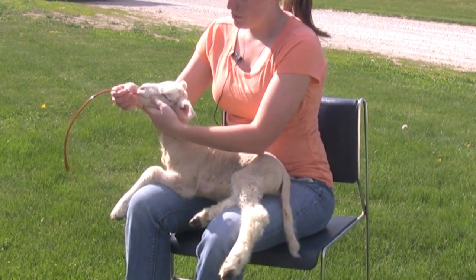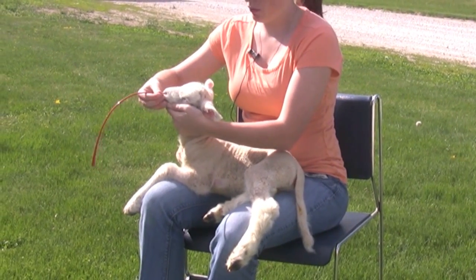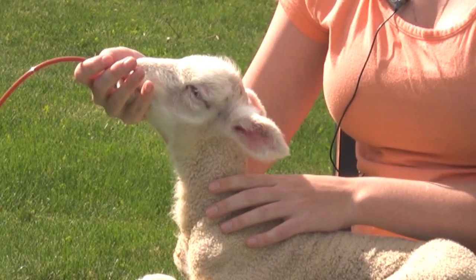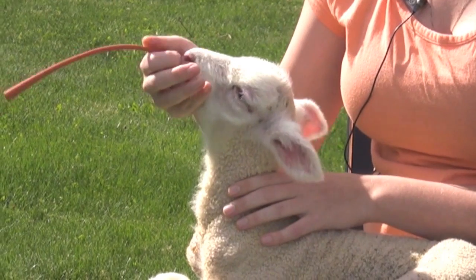Begin with the tube unattached to the syringe and insert it gently into the lamb's mouth, slowly easing it towards the back of the mouth. You should not have to apply much pressure as the lamb should naturally swallow it. If the lamb is chewing on the tube, it is swallowing it. Take your time and be gentle.